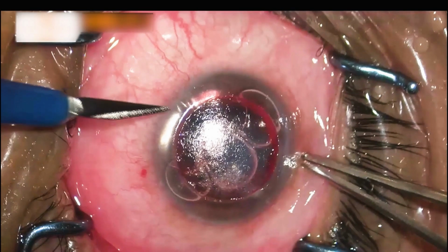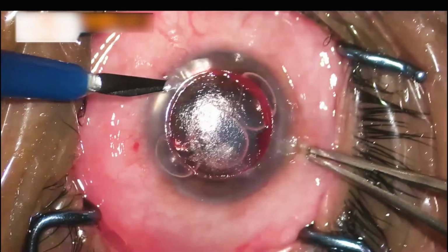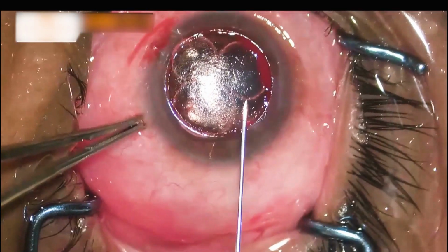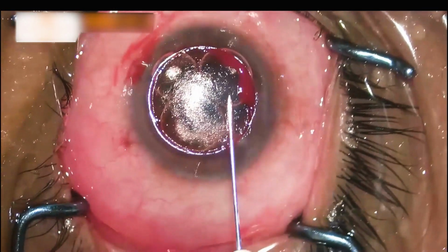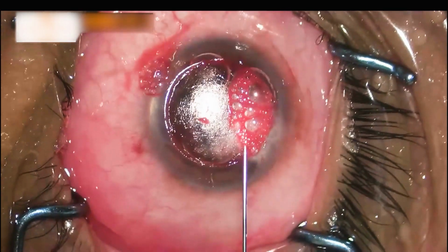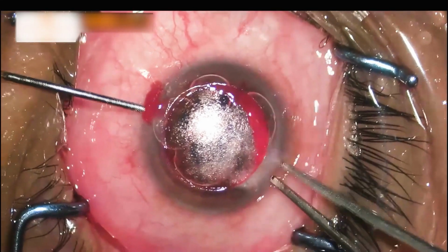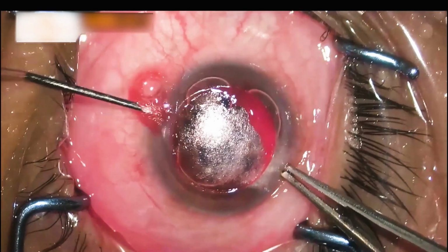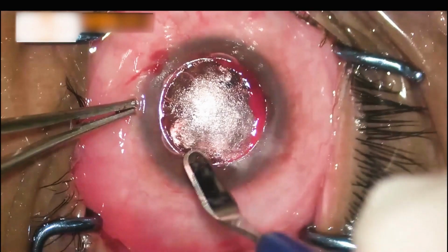Keeping in mind the previous experience, we try to deflate the type 2 bubble using a 15-degree knife. A second attempt is made to achieve the desired type 1 bubble, but this attempt again leads to formation of a type 2 bubble. The air from the type 2 bubble is burped out from the side port. Now it is decided to proceed with manual dissection using a crescent knife.